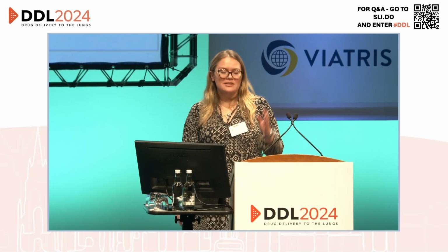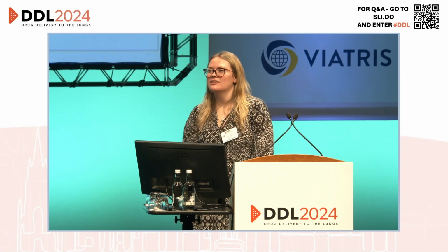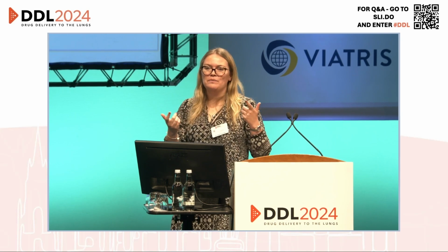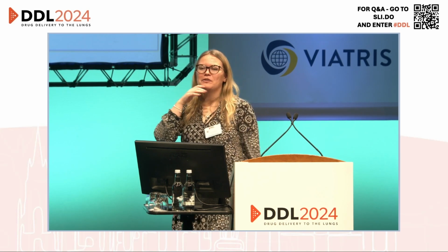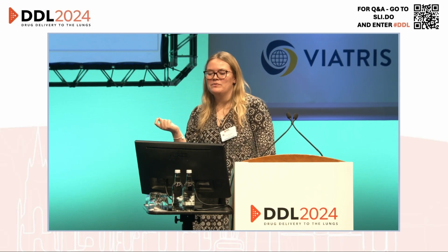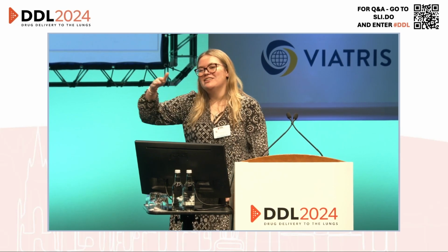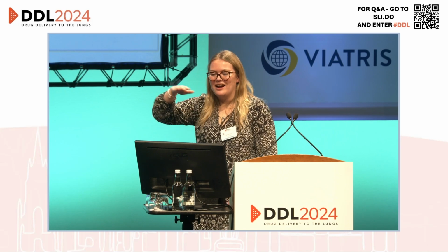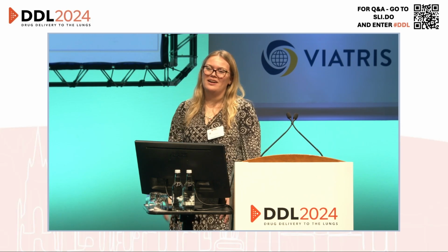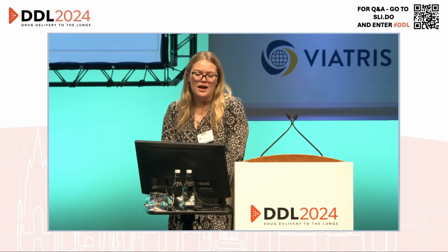Yeah, the thickness is a really important question and one I really wanted to answer during this talk. I went to Aptar to conduct some X-ray tomography experiments to have a look at the mucus thickness, to see if we could benchmark the in vivo mucus thickness, which is around 50 micron, which is quite small. Unfortunately, due to the sensitivity of the equipment, even if we coated the cast and could see that mucus was in the cast, we couldn't detect it on the equipment. It was such a shame because I wanted to show you some nice images of the tomography, see the thin layer of the mucus and quantify how thick it was. But that's still ongoing and maybe a limitation to the study that I've done. But yeah, very good point.